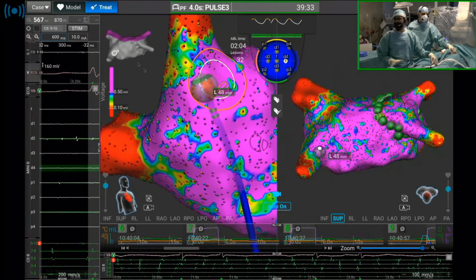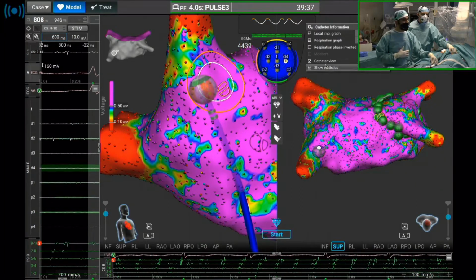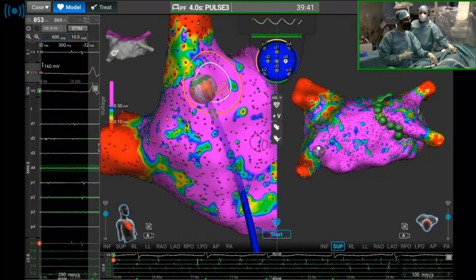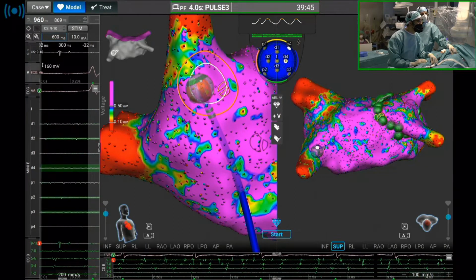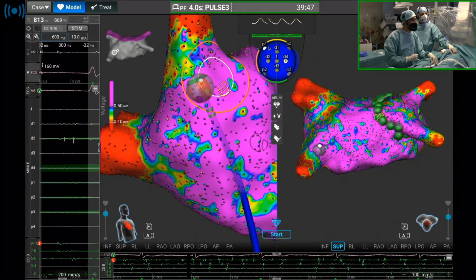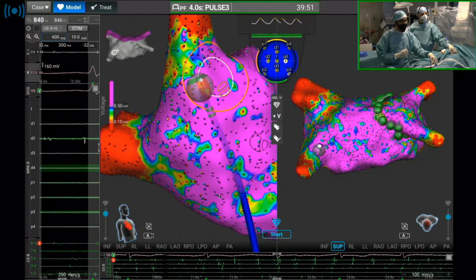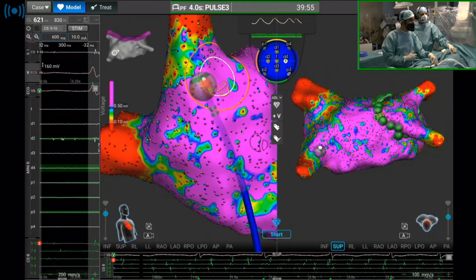Now ignore the patches in the voltage, because this is mapped during AFib, so the voltage is not very accurate. We'll do a voltage map after we ablate, but you can see the number of points, and you can see the size of those points. And obviously with 9 very tiny electrodes on the catheter, we can record very small signals, and we can do it very quickly, as you saw yesterday.